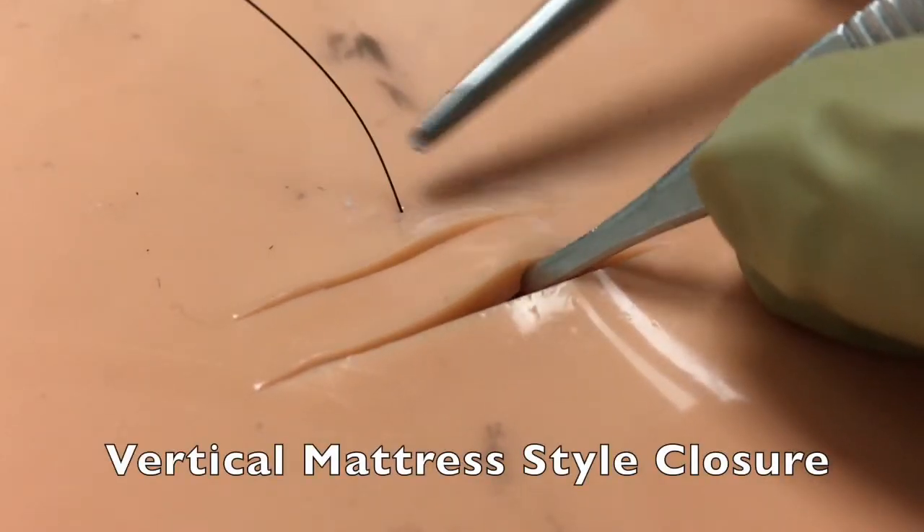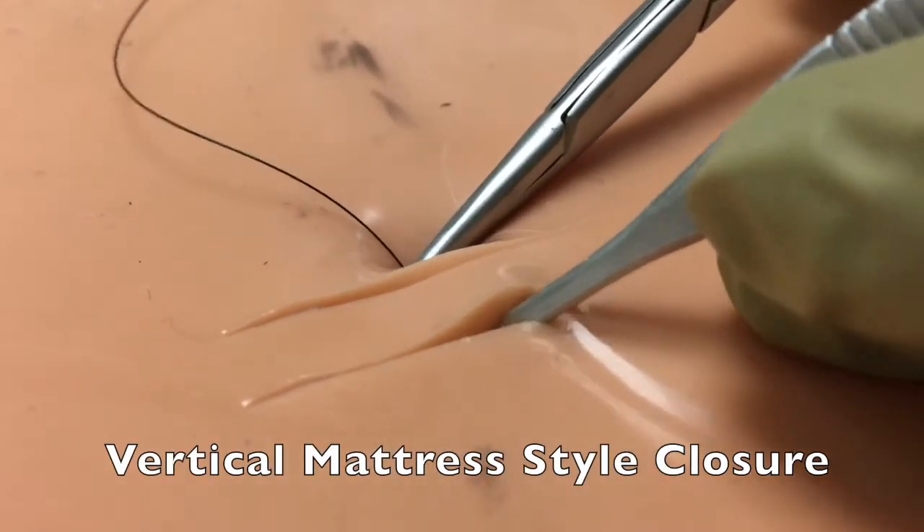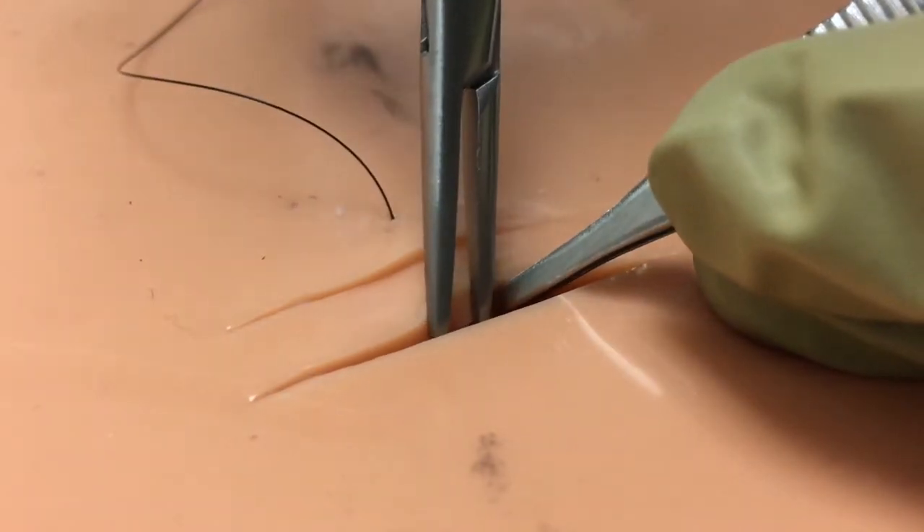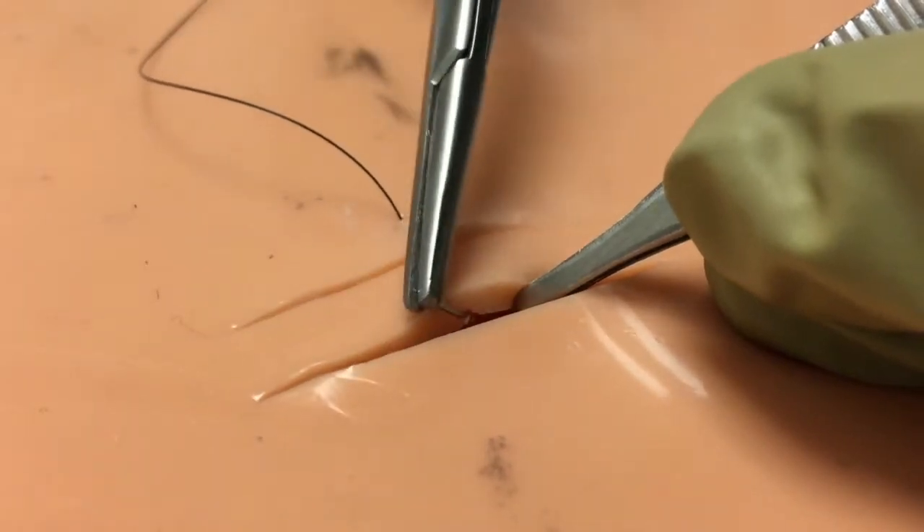In the technique that's described, you'll see use of a vertical mattress style suture in order to bring together the edges of these parallel lacerations and approximate the intervening tissue island.